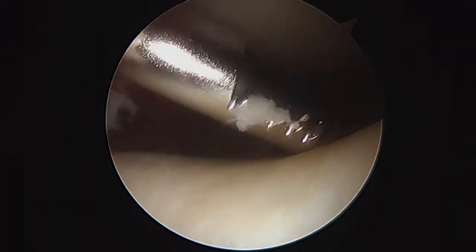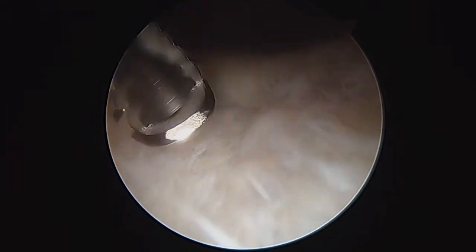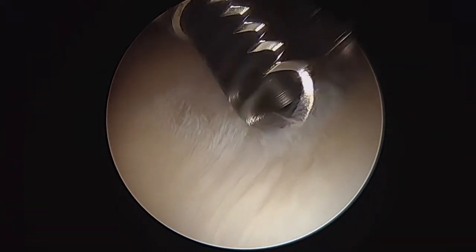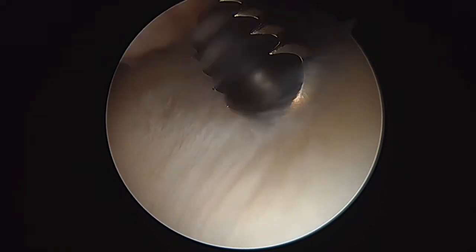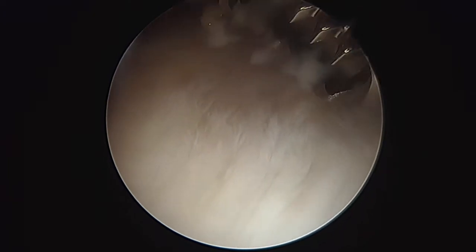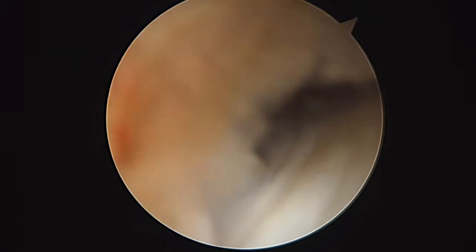Now we're looking at the patellofemoral joint. What we're seeing here, as we suspected, is a fair amount of wear and tear changes in the trochlea — see how this is really rough right in the middle? That's the area where when you get arthritis, it can hurt when you're going up and down stairs. It hurts first thing in the morning, before the knee gets warmed up, after sitting in a movie, long car rides, long dinners — all those things. That goes along with some of what you were telling us, so that's why we expected to find this.